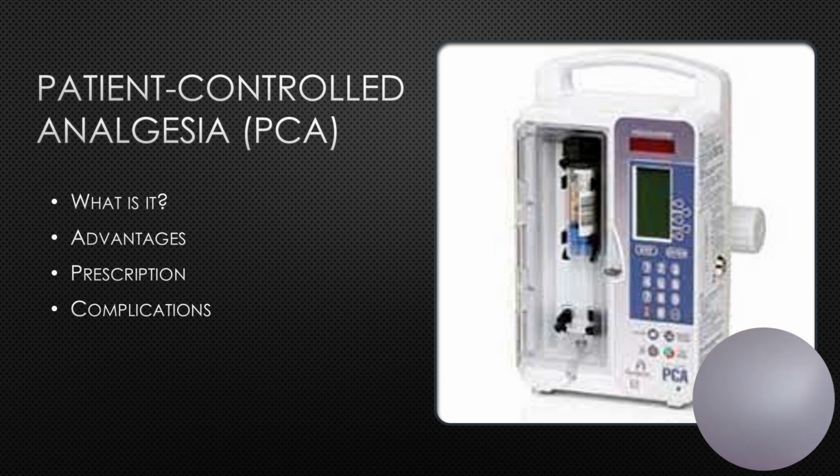The client can push that button 100 times in that 10-minute time frame, but if that 10-minute lockout time has not passed, they will not receive any medication until 10 minutes has passed. Then they will receive one dose. They're locked out for another 10 minutes. The machine does have a lock on it to prevent tampering with the dosages, etc.